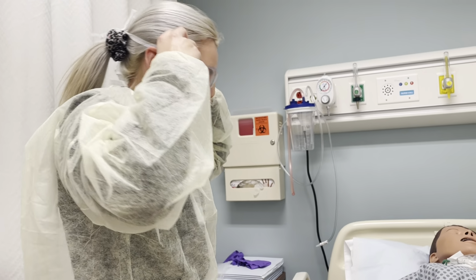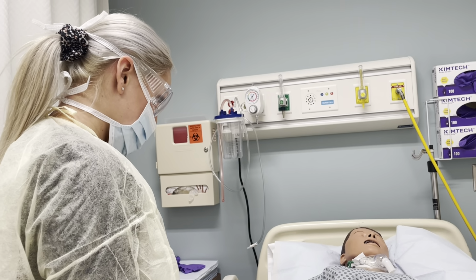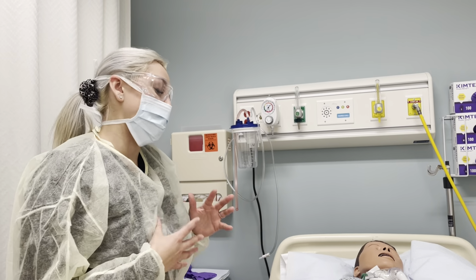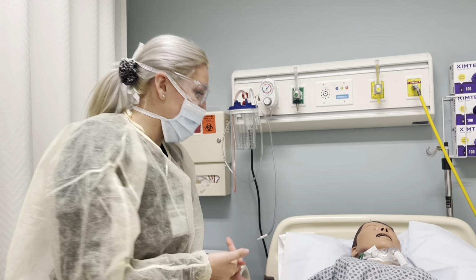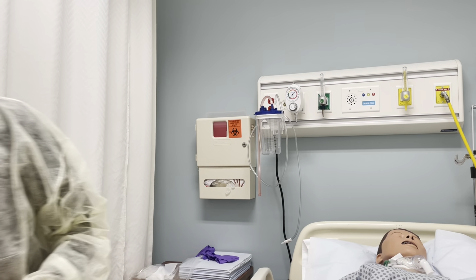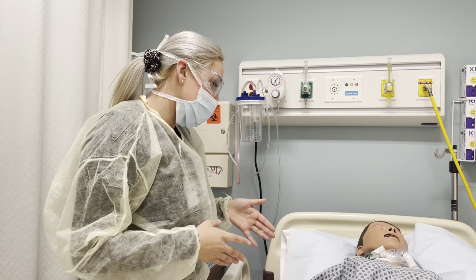Okay, can you state your full name and date of birth? Kimberly Alvarez, January 17, 2003. Okay, thank you so much. I'm going to now identify the need for any analgesics. There is no need, so I'm going to now close the curtain. All right, and then I'm going to explain the procedure to you.